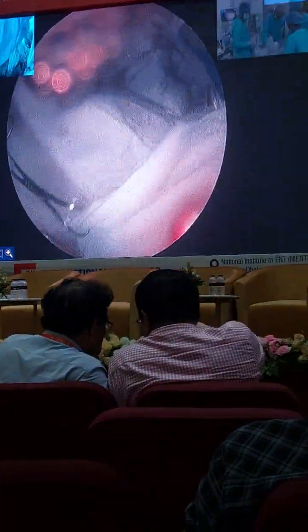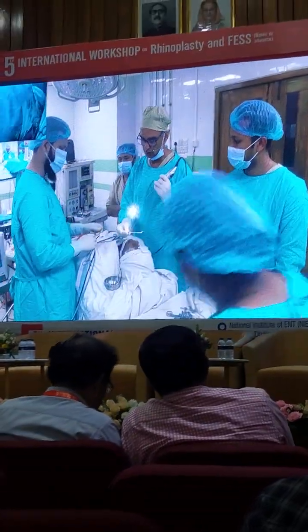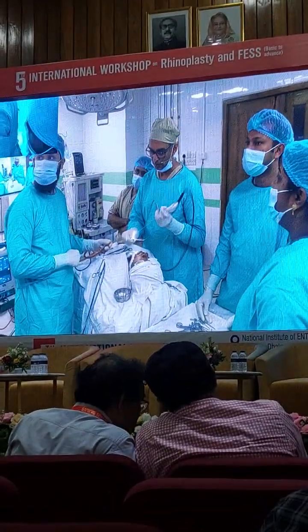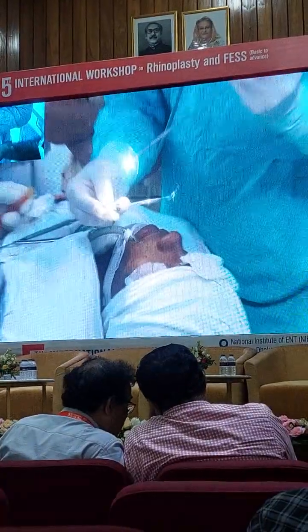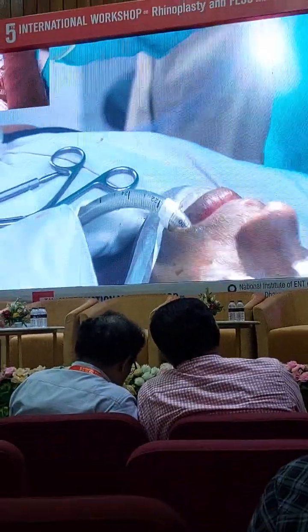So I like to use my throat suctions. There's a big difference between the regular throat suctions and mine. You will see it has what we call a keyhole. Can you see this keyhole? Better option. Yes, sir. So when I put my finger, I can control from here how much suction I want.